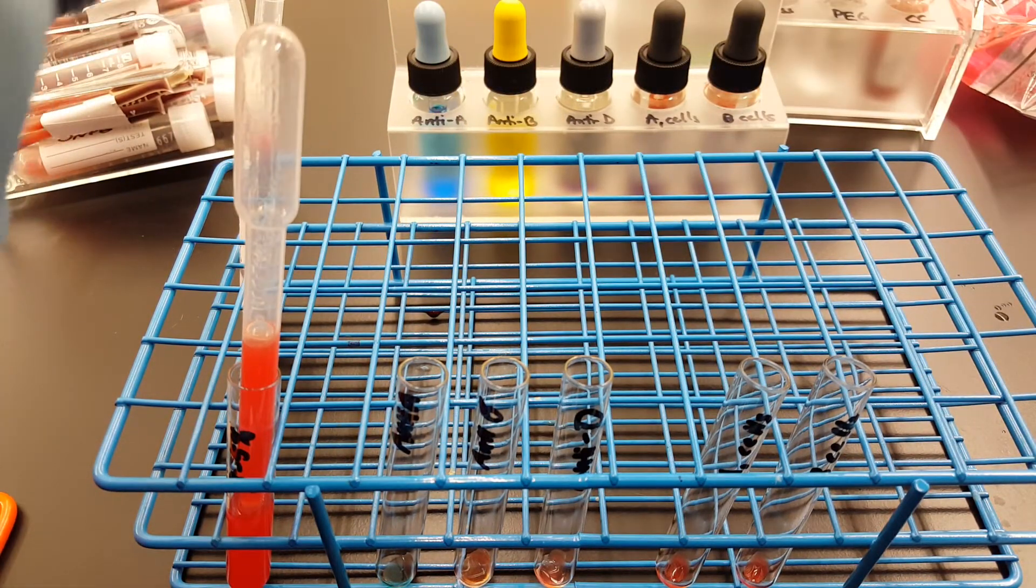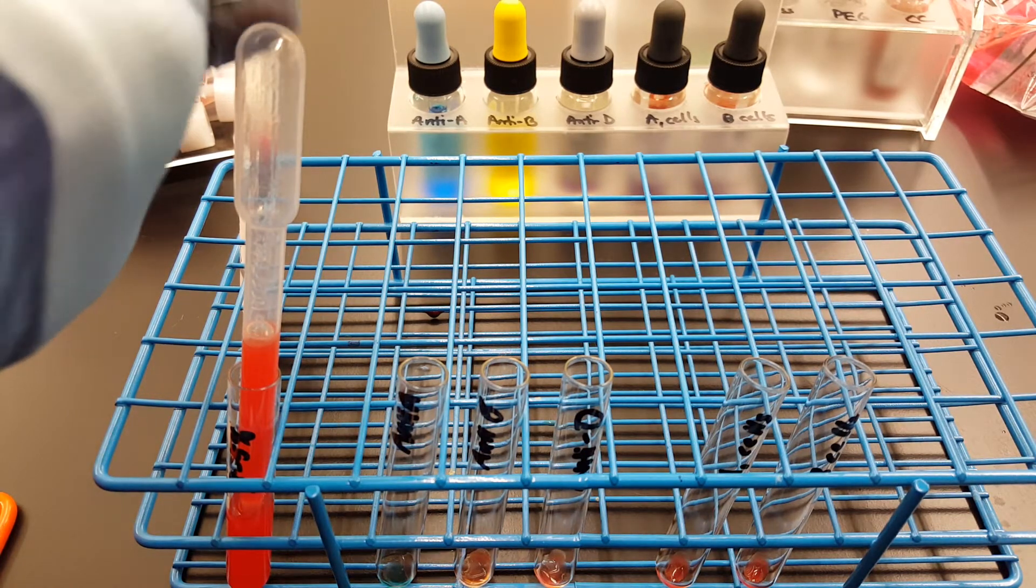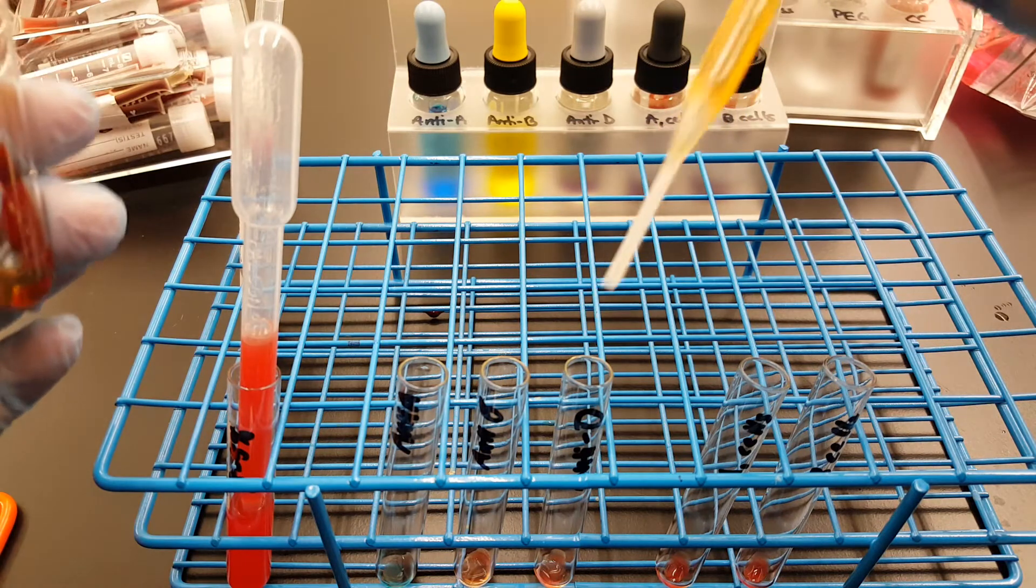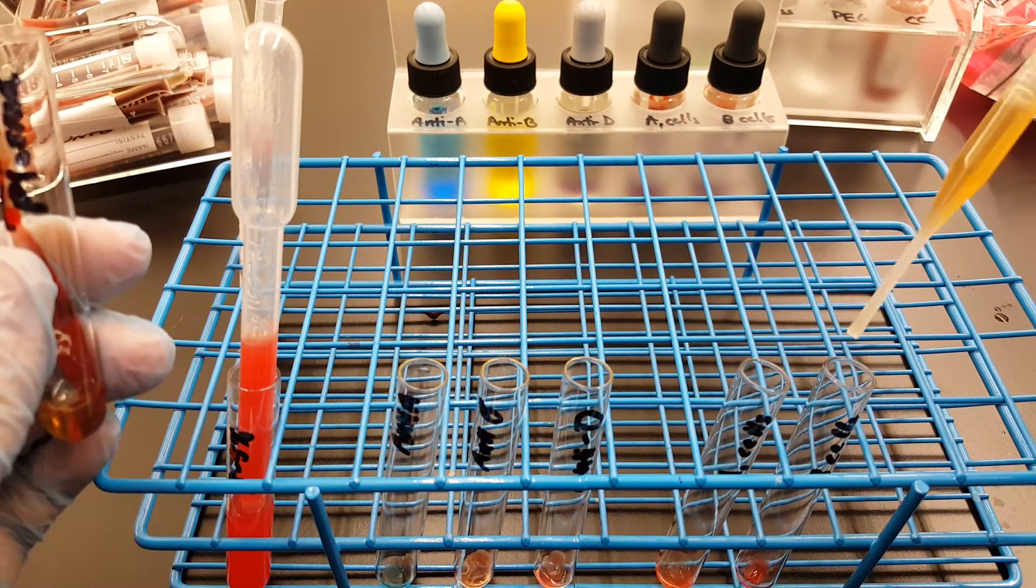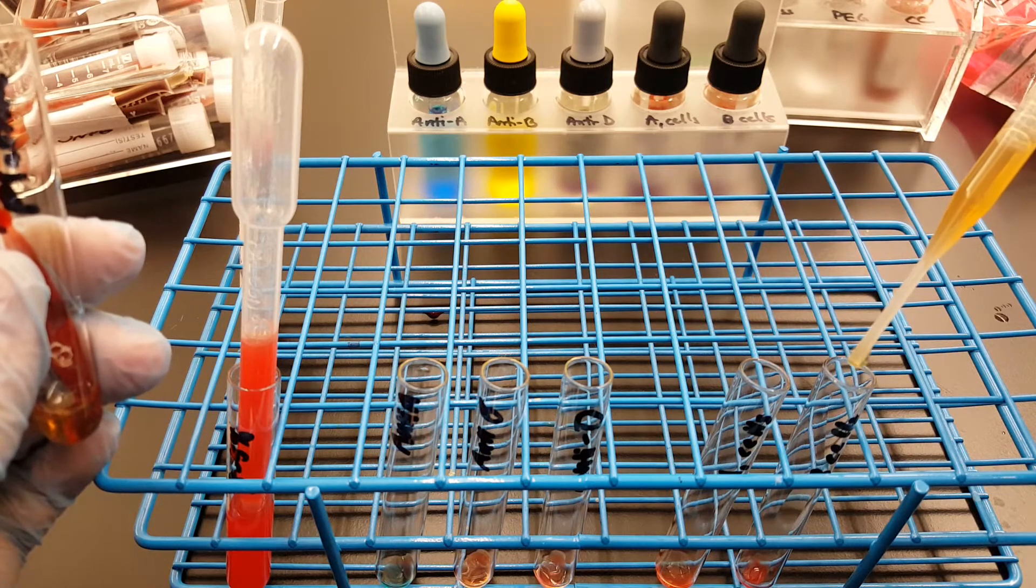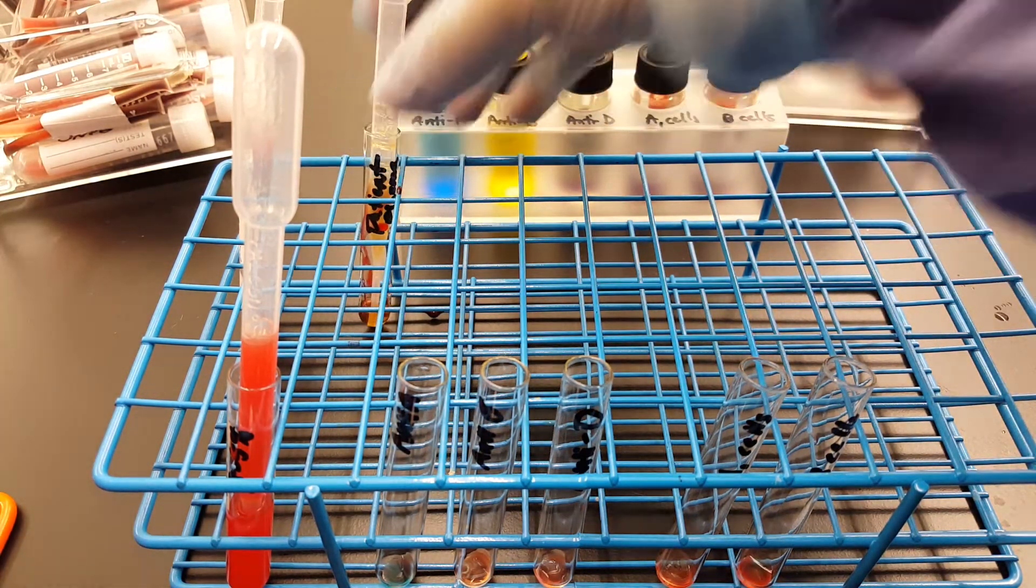Okay, and then we're going to take the plasma that we took off earlier and see how nice that is, and we're going to add two drops. Now the thing that is kind of confusing is why do we add one drop of the reagents and two drops of the patient's plasma.